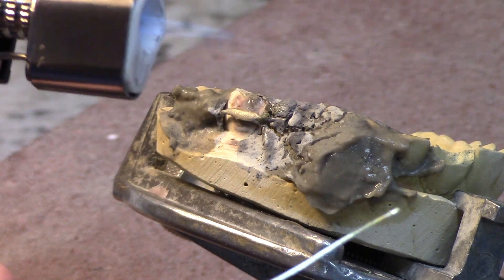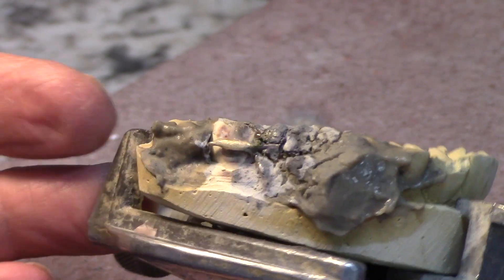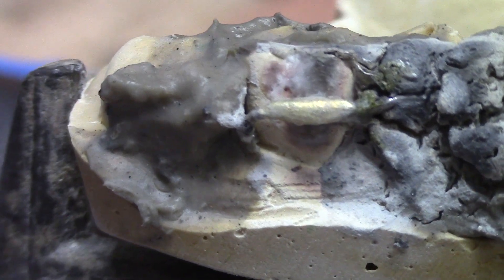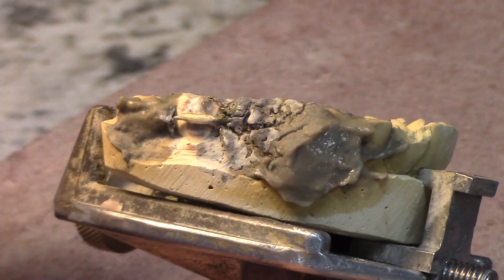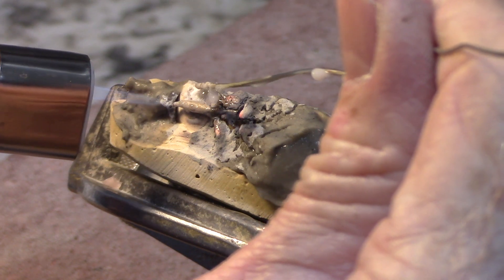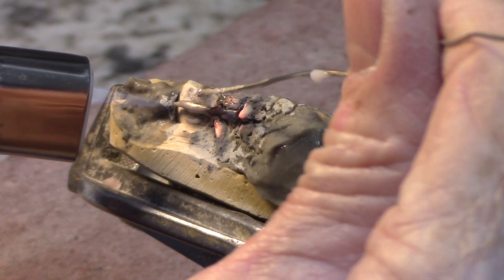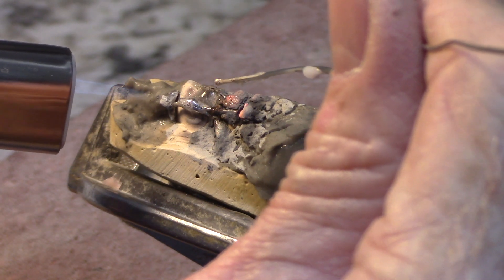I'm going to put a little more flux on there, and I like to put a little flux on my solder too at this point. I'm going to melt just enough to completely encase the wire. The end of the wire — as soon as I hit that with a polish wheel it's probably going to expose it, so I'm going to add some more solder to keep that from happening. I don't want the end of the wire to be exposed.